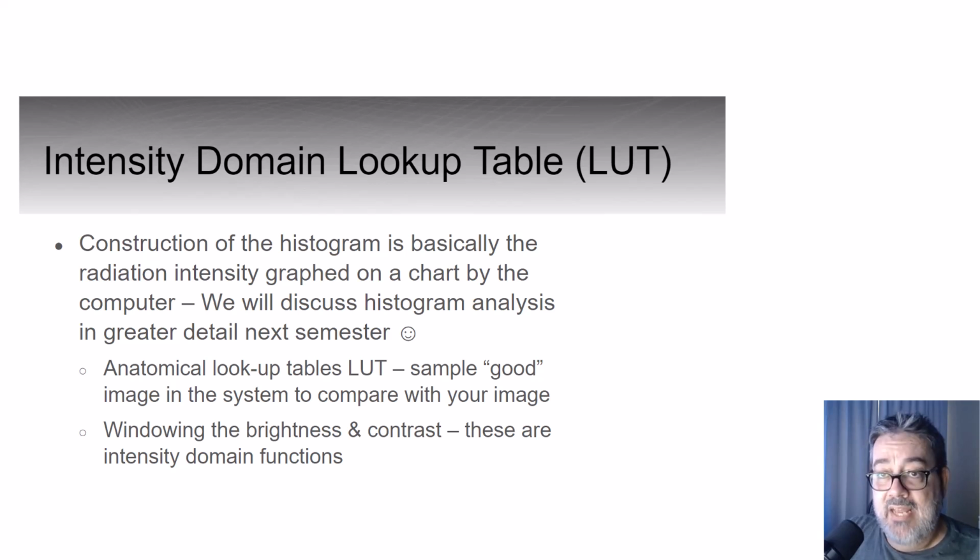Back in the film screen days, we didn't have to consider processing algorithm. The only control we had was the type of film and cassettes we were using, along with our kVp and mAs values. When we first switched to CR, we didn't know why we were sometimes using optimal technical factors that worked for film, but the images weren't coming out like we needed them to. The sales reps from the vendors like Fuji and Kodak, now called Carestream, didn't know how to guide us at the time, but what some did as a workaround is change the processing algorithm after the fact.